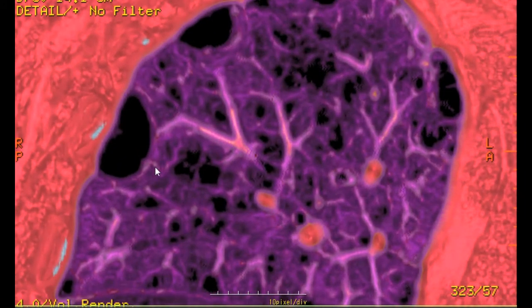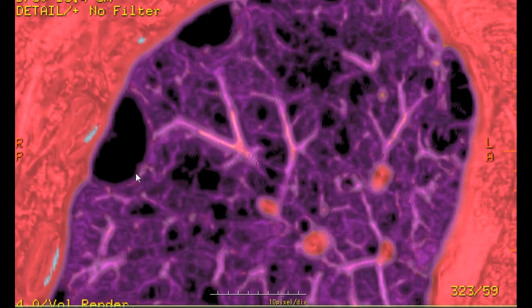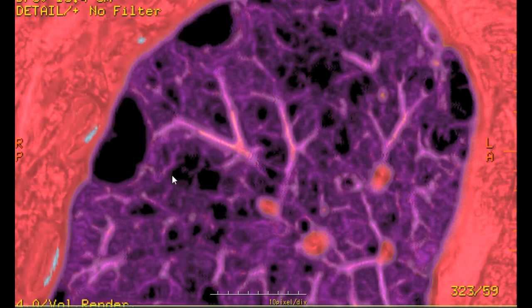Here is the bulla formation. And this area here is ruptured alveolar. These areas here and there are also ruptured alveolar.